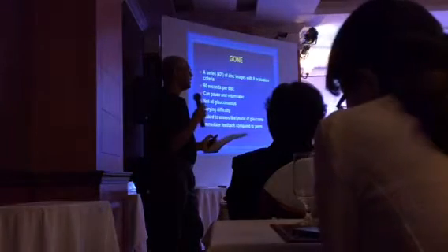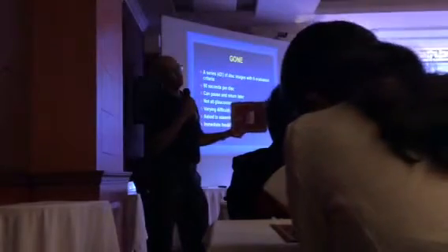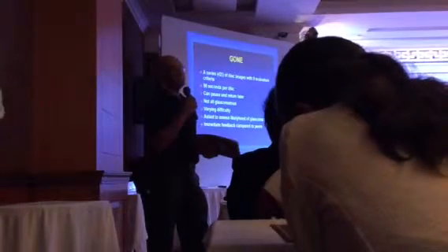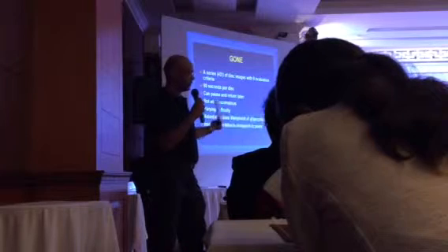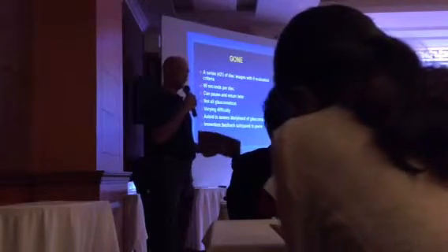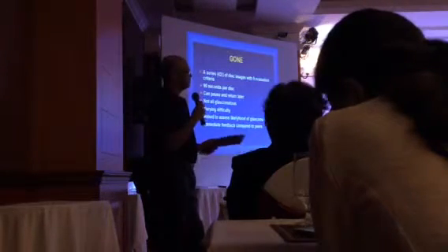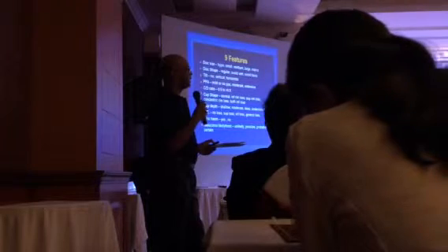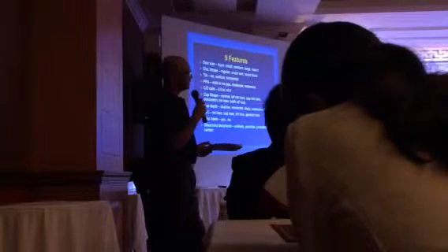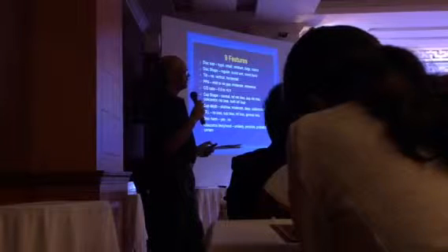So the only problem with the online assessment of the disc, like with any photograph, is that you don't have stereopsis. You also don't get to see the other eye, so you don't have that perspective. The 9 features that they have used are listed there.